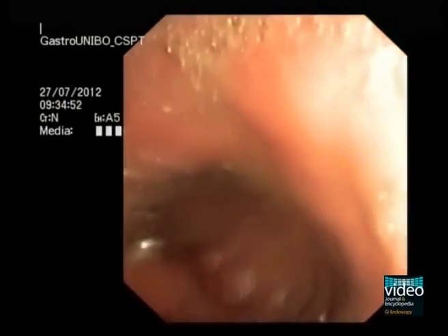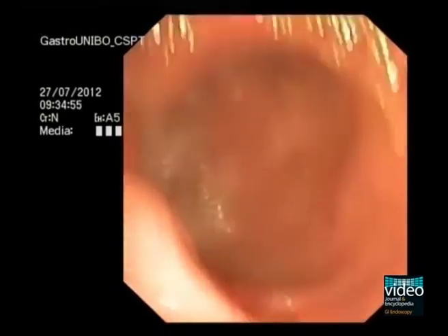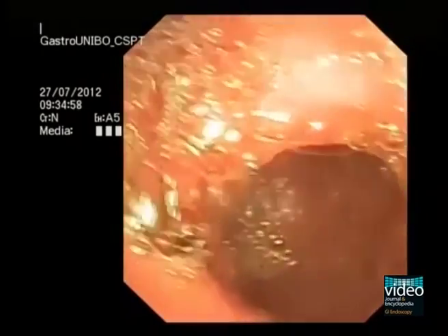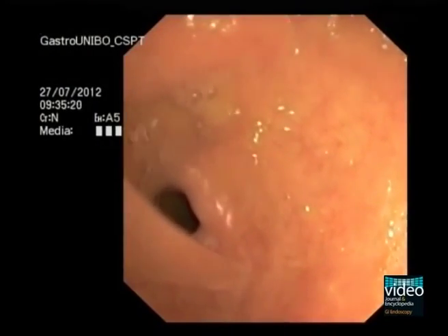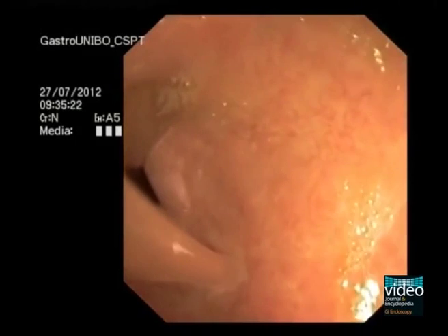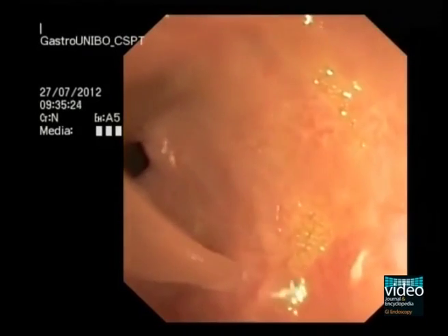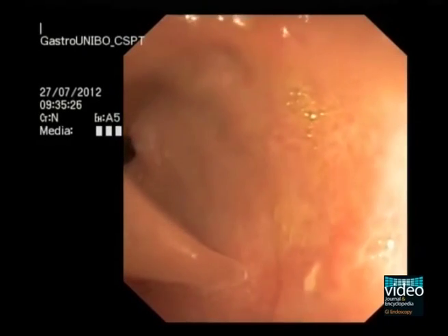In the stomach, full endoscopic view is achieved, allowing proper orientation and positioning of the echoendoscope in relation to the lesion of interest. Water filling of the gastric lumen is essential to obtain good coupling of the ultrasound waves with the gastric layers.